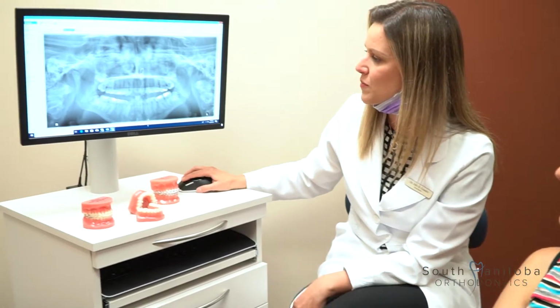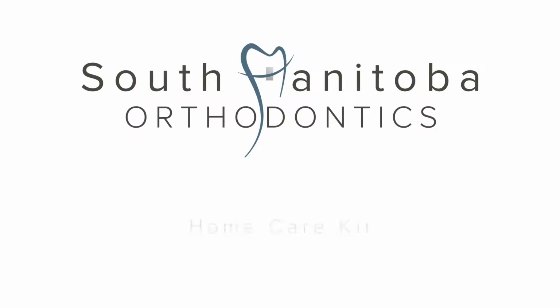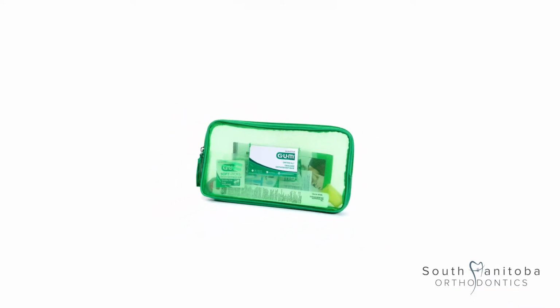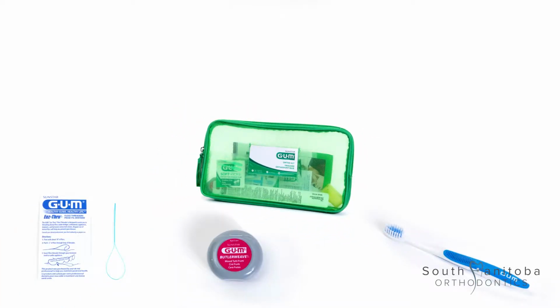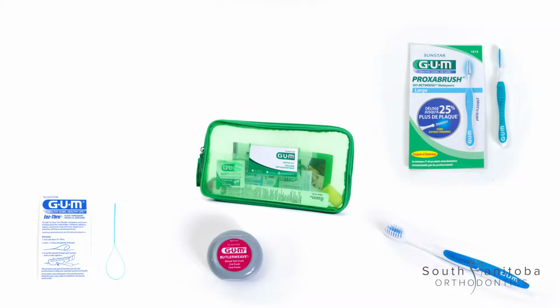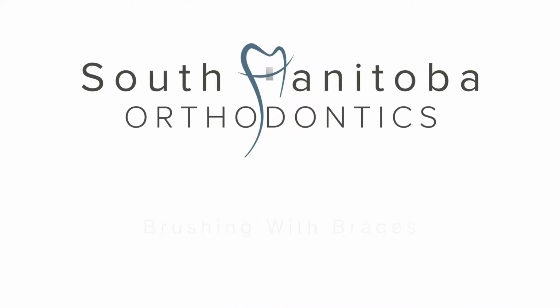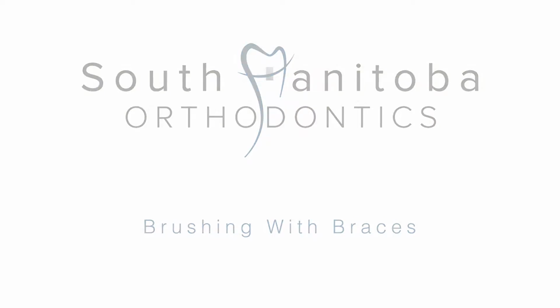Now, let's get started. Now that your braces are on, let's review your home care kit, which includes a few things to help you take care of your braces. There's a toothbrush, floss and floss threaders, a proxy brush, wax, and an instruction sheet. Okay, now down to business, and let's start with how to brush your teeth with braces.